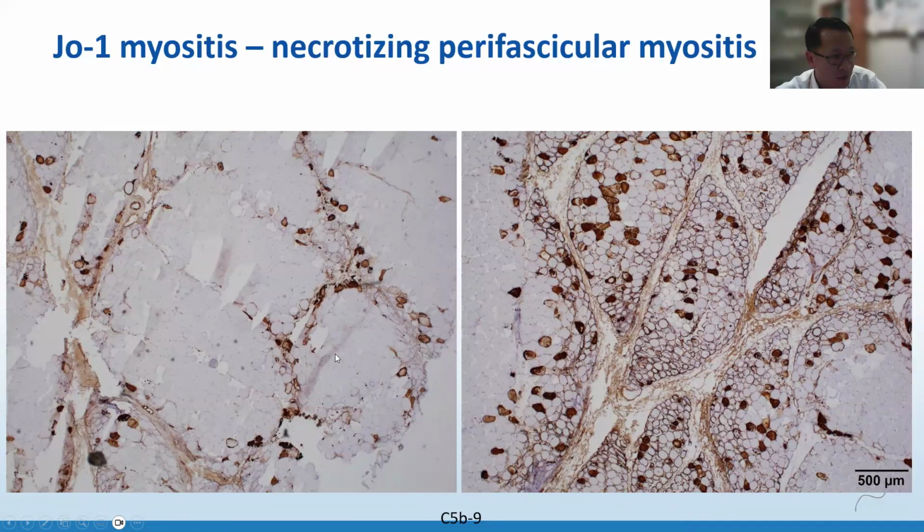So there is typically very little capillary staining. This case shows some, but usually it's very equivocal or weak. And they can have this pretty restricted perifascicular necrosis pattern, or sometimes you can also see them in the middle of the fascicles. And this is a case with prominent sarcolemmal staining in the viable fibers as well, which has a perifascicular accentuation here.